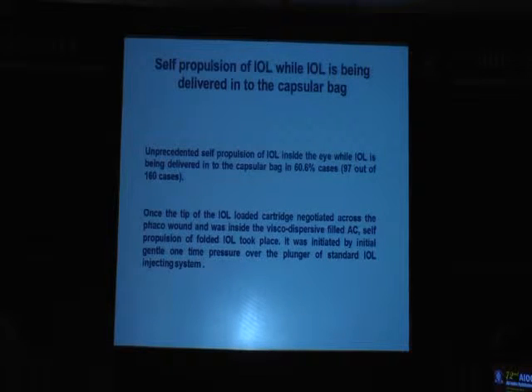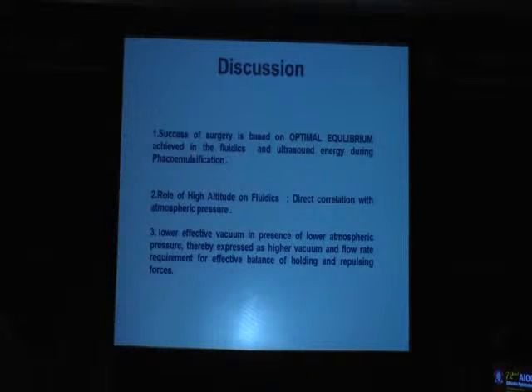Another important thing was the self-propulsion of the IOL while it is being pushed into the anterior chamber. The moment a slight push is given and then withdrawn, the IOL passes through automatically due to the variation in atmospheric pressure, and it is self-delivered.